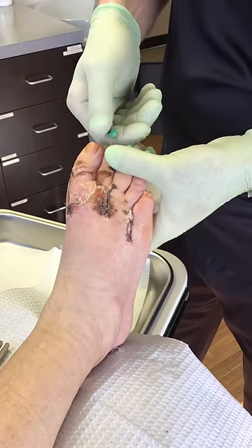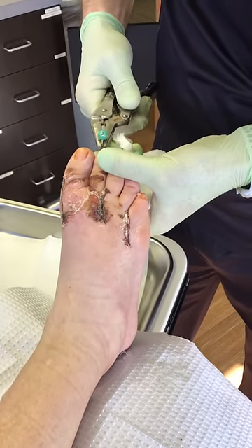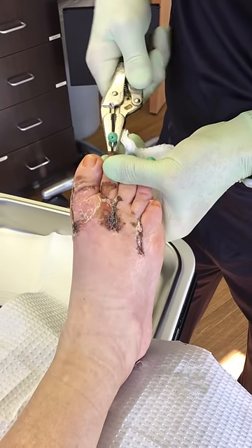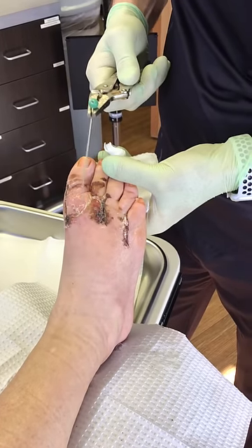So we got pins in about three weeks ago. We did a reconstruction, and so we're gonna pull the pins out now. A little bit of pressure as they come out. Here we go. There's one.